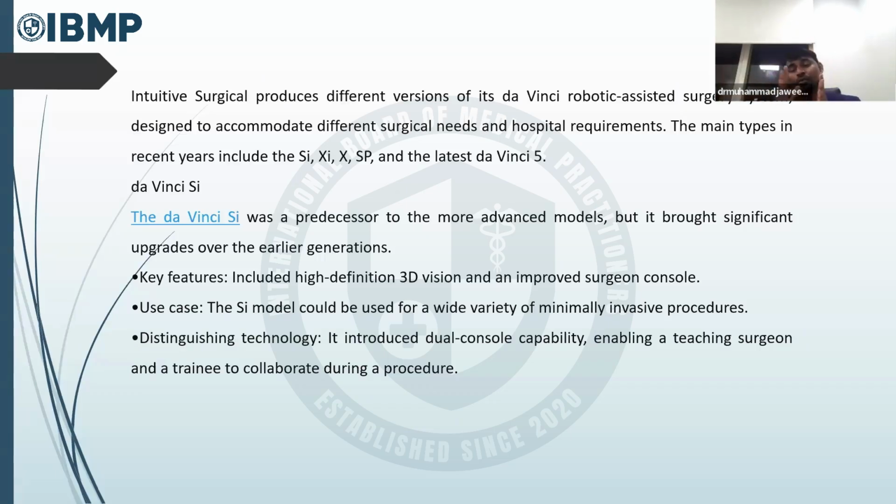So, as the years progress, the advancement increases. So, more depth perception, more advancement in the camera, and more advancement in the surgeon console, in such a way that the surgery goes smoothly and the operating time decreases. The SI model could be used for a wide variety of minimally invasive surgeries.